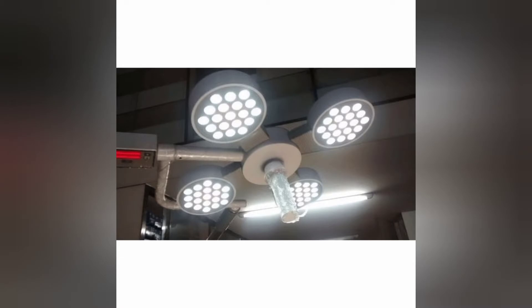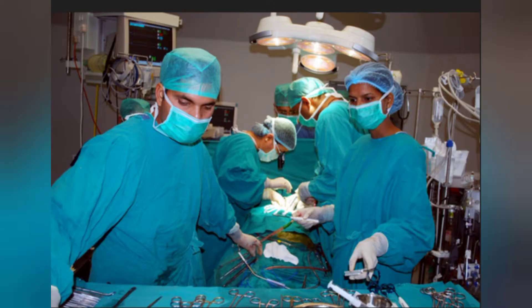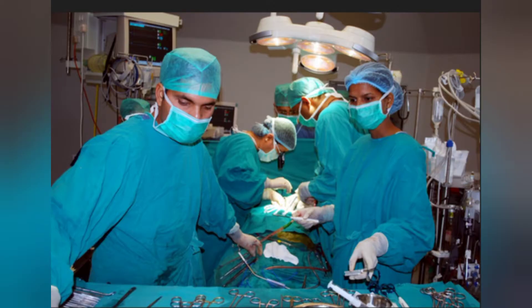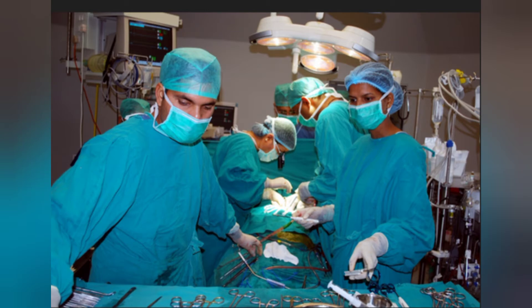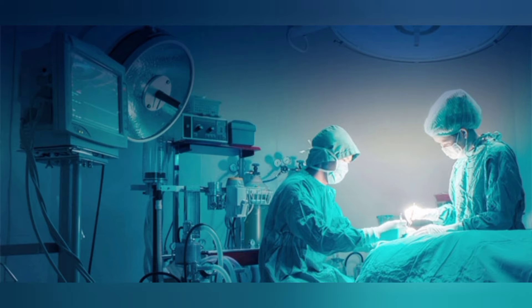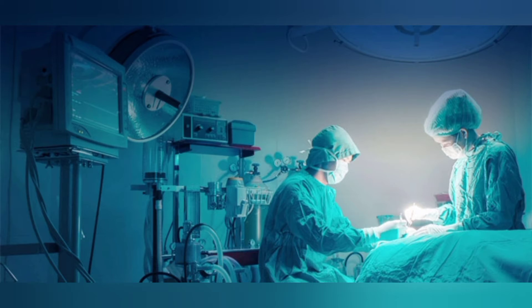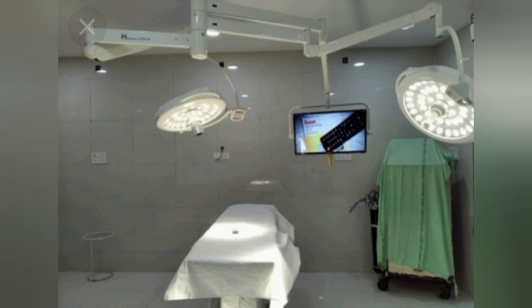Our next equipment is the OT light. For every surgical procedure, proper light on the surgical area is very important and essential. The light should offer proper illumination whether the surface is flat or uneven. Illumination should not be affected by obstacles like the surgeon's hand, head, or any other surgical instruments. Also, OT light should not produce heat on the active area — it should produce cool light.